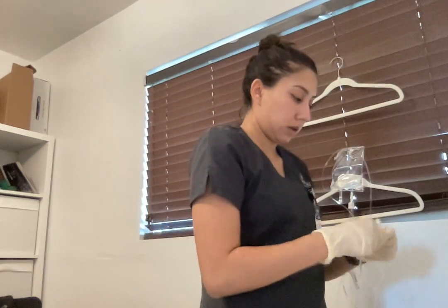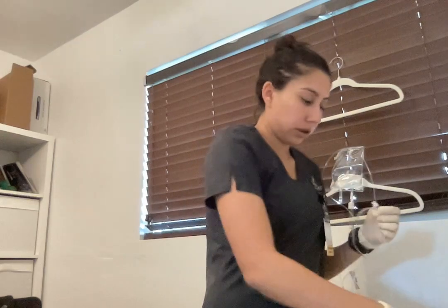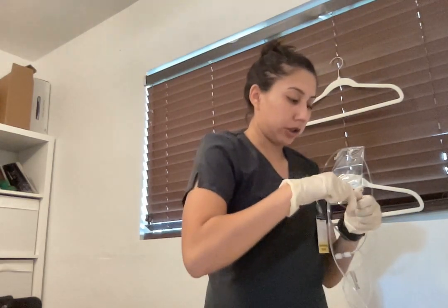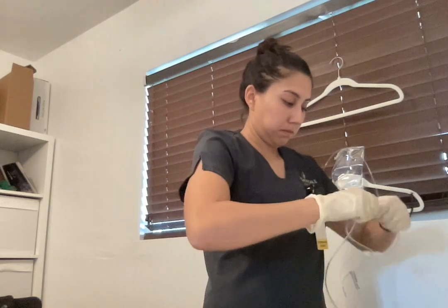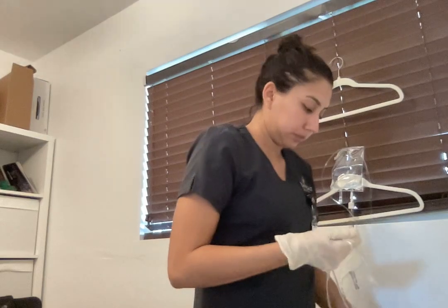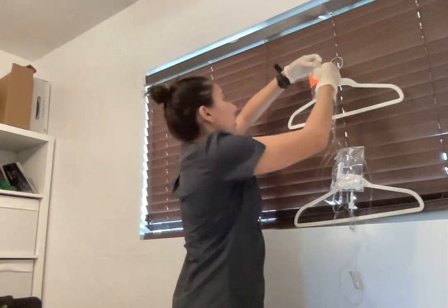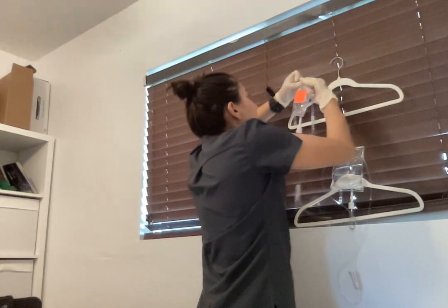Now I'm gonna wipe down the Y port right here and place the piggyback tubing into here because this is the medication. And then this adapter will go into the patient's IV. I'm gonna hang the medication higher because it's the medication.